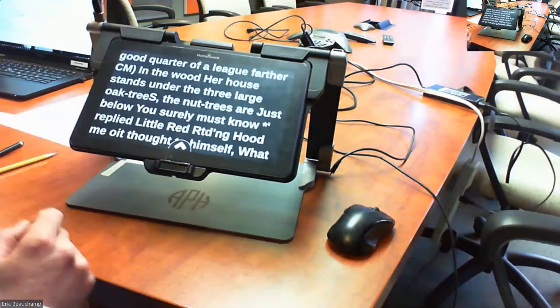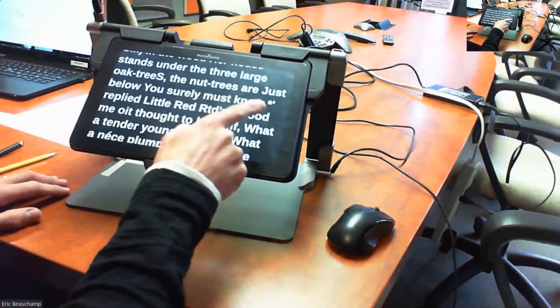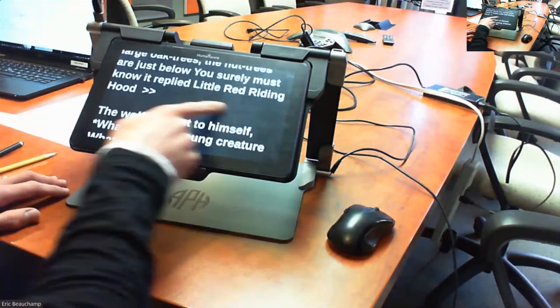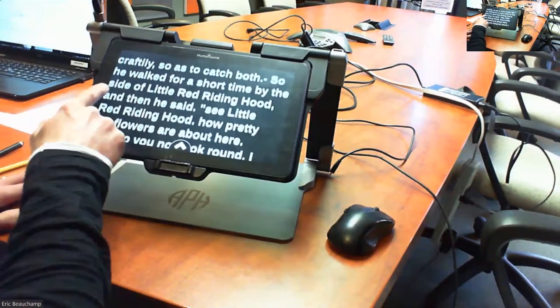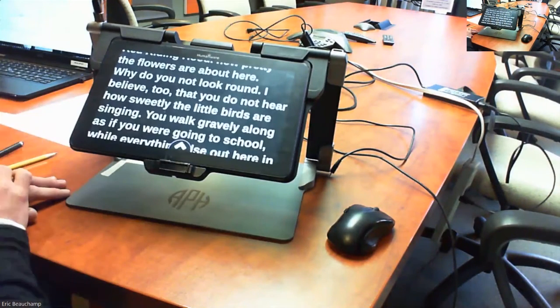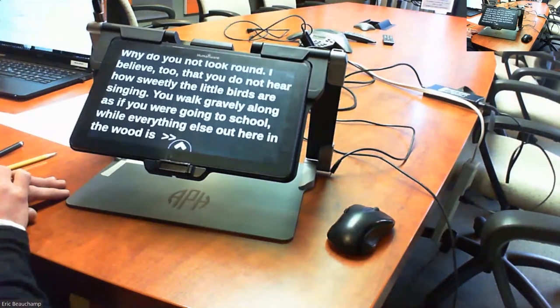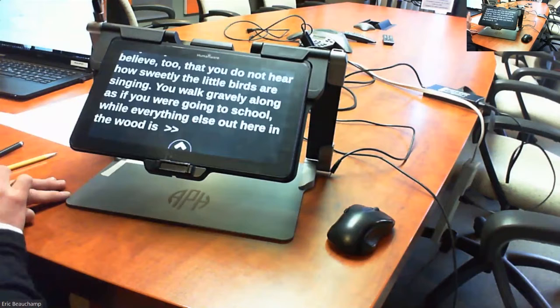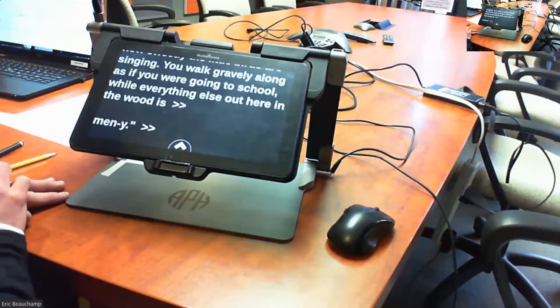It's going to switch to my column mode, because I can set it to column mode. This is what I use. Then you can just swipe on the screen and it's going to go faster through it. Now your student can read through that at his or her own speed and it helps with understanding what they're reading. Like I said, with the audio, students can sometimes get a bit lazy.